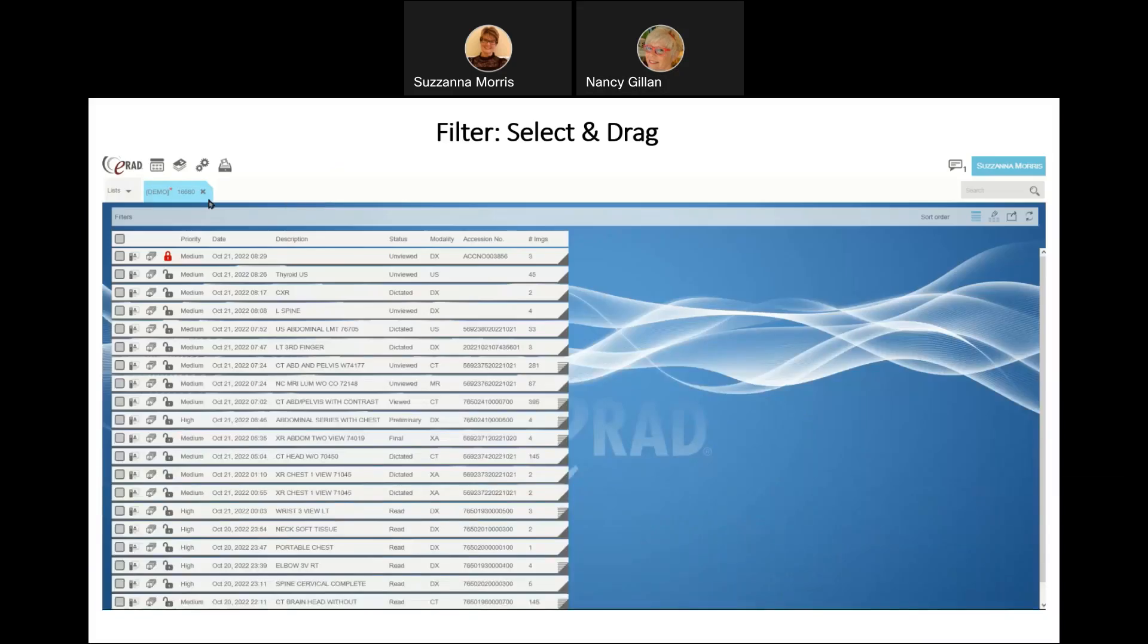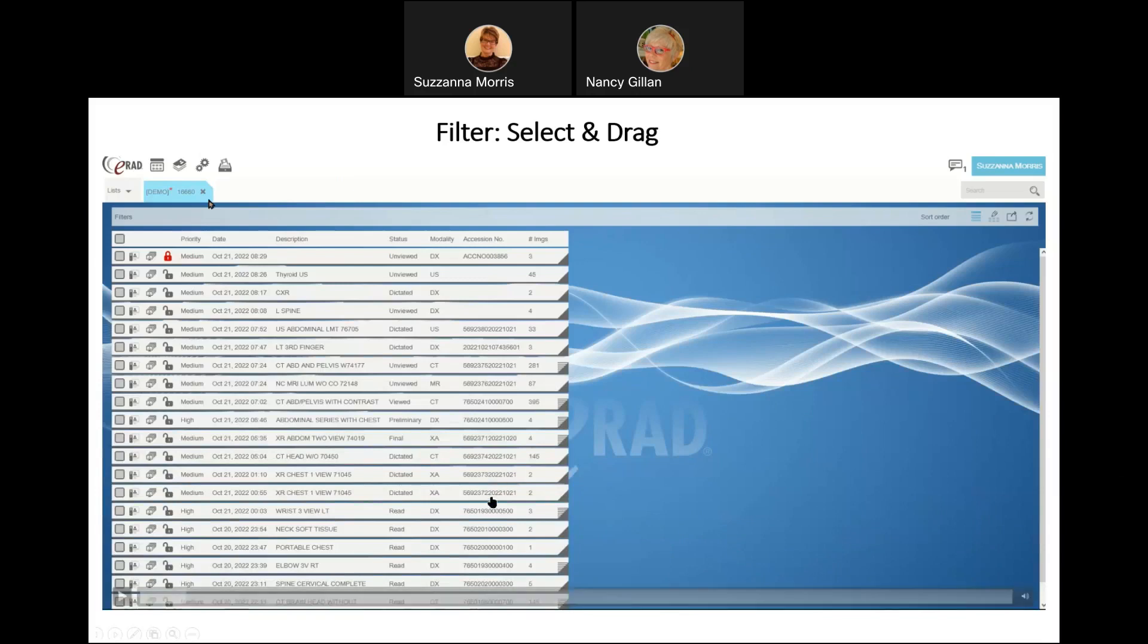In order to search for a specific study or group of studies on a work list, you need to apply a filter. A work list filter is a set of matching criteria applied to the complete study list. You can see that I've queried this entire system and pulled in over 16,000 studies on this list alone.